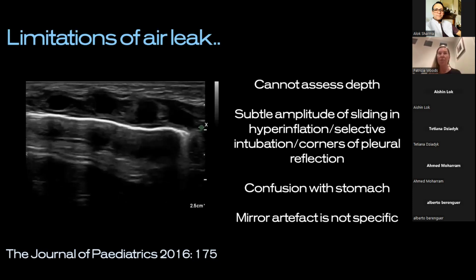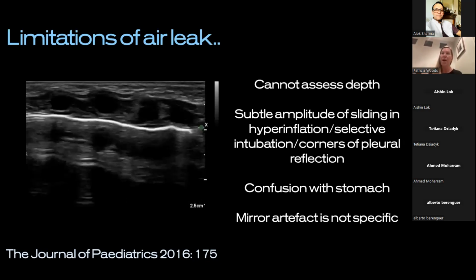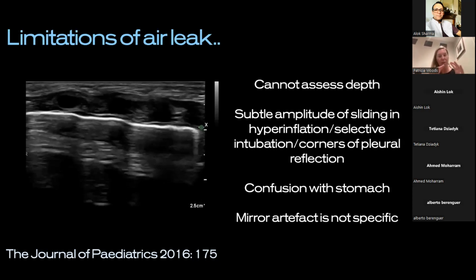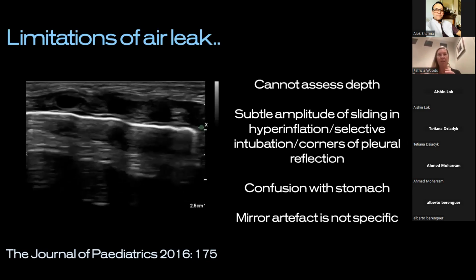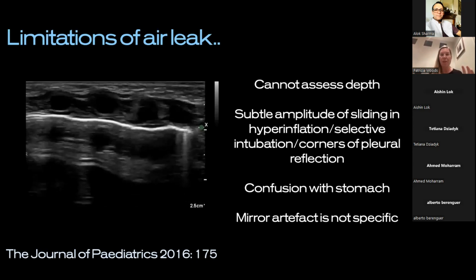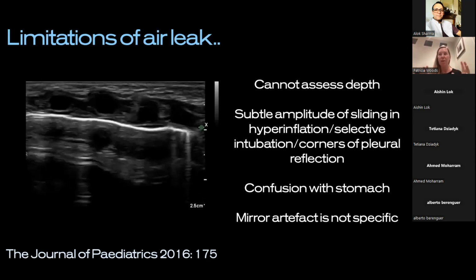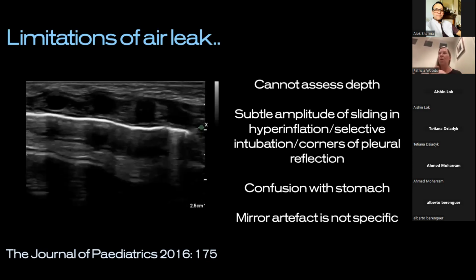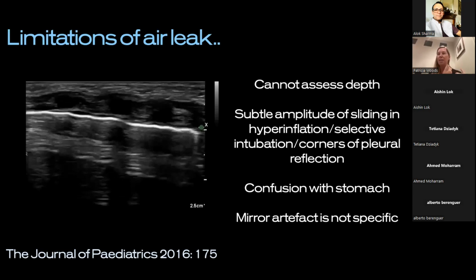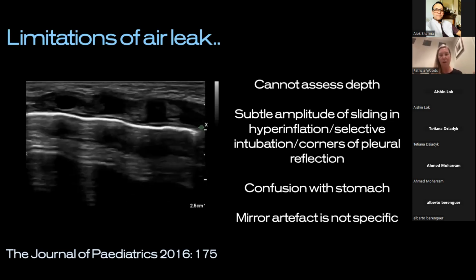What you can do is think about the baby's positioning that the baby's nursed in, and mark out, if need be, where these areas change, where you might identify lung point, where it's normal, where it's not. But it can be really, really tricky, guys. Some people will like to look at X-rays and sort of say, yeah, if it's more than 2 centimeters or hits the mid-clavicular line, then it's got to be significant. I don't play with hard and fast rules. I think you have to apply it.